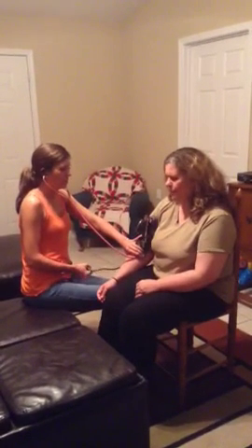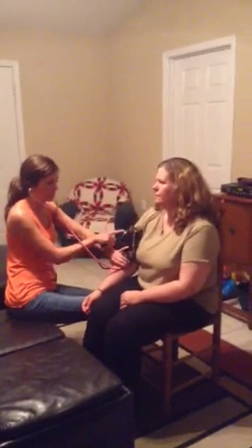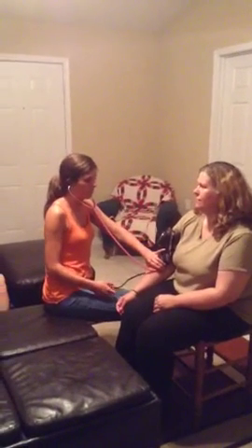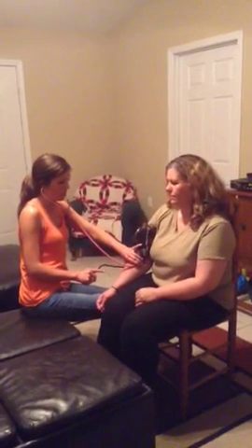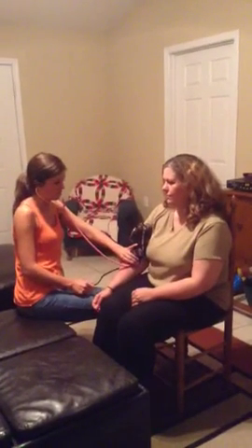While you're pumping, it can be noisy in doctor's offices, so you can watch the dial jumping. You then release the valve, and the first number it jumps on — the first part you hear — is the systolic number. The last number you see, or the last part you hear, is the diastolic number.